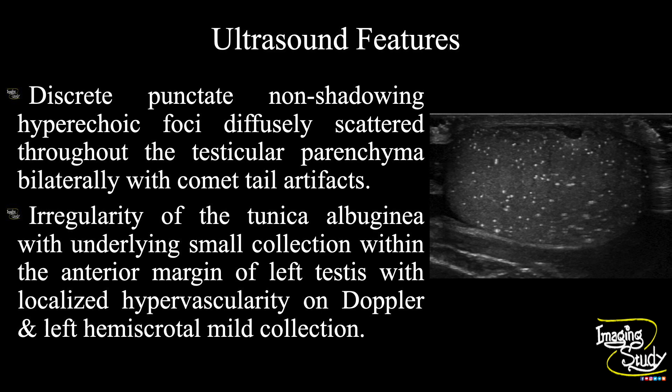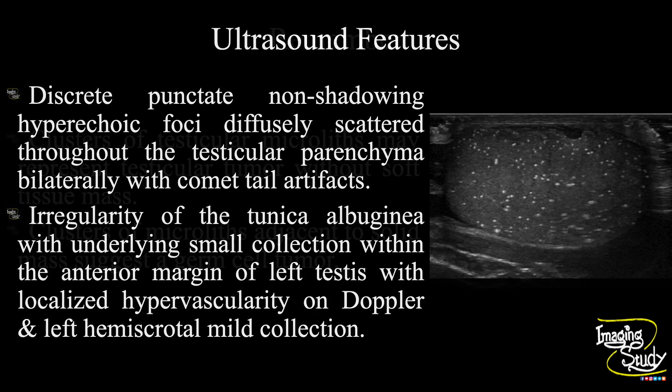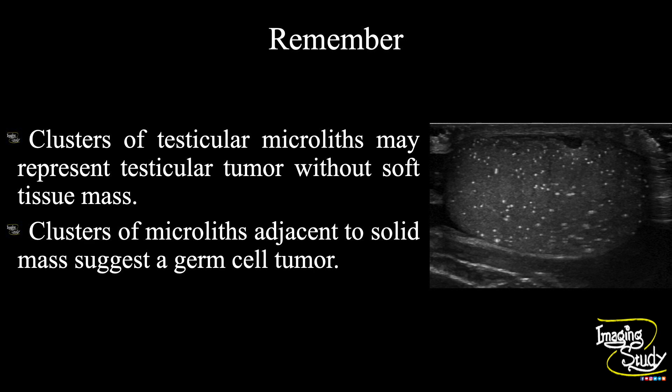So, in summary: discrete punctate non-shadowing hyperechoic foci diffusely scattered throughout the bilateral testicular parenchyma with comet-tail artifacts, indicating bilateral testicular microlithiasis. There is an irregularity of the tunica albuginea with underlying small collection within the anterior margin of the left testis with localized hypervascularity on Doppler and left hemiscrotal mild collection, indicating left testicular hematoma. As a take-home message, clusters of testicular microliths may represent testicular tumour without even the presence of a soft tissue mass on ultrasound. Clusters of microliths adjacent to a solid mass will suggest it as a case of germ cell tumour.